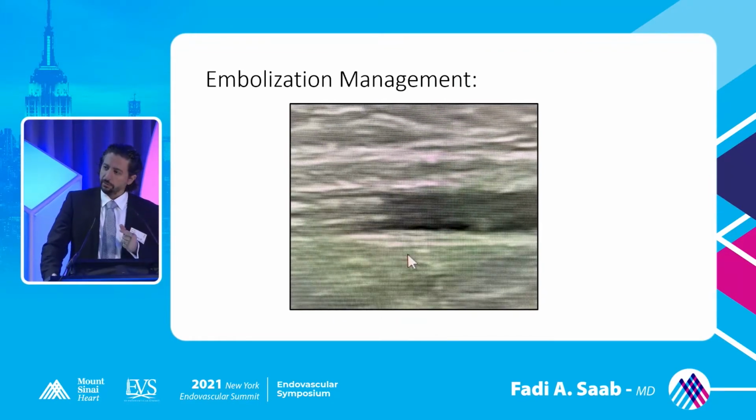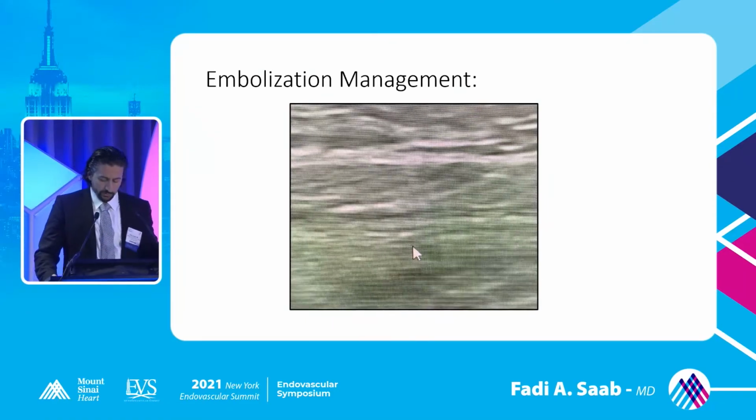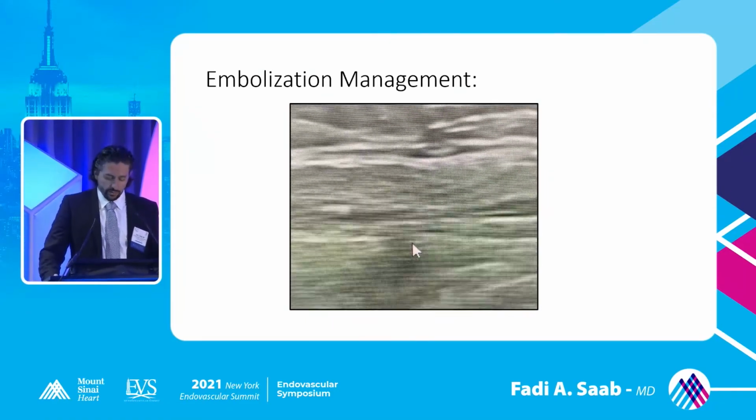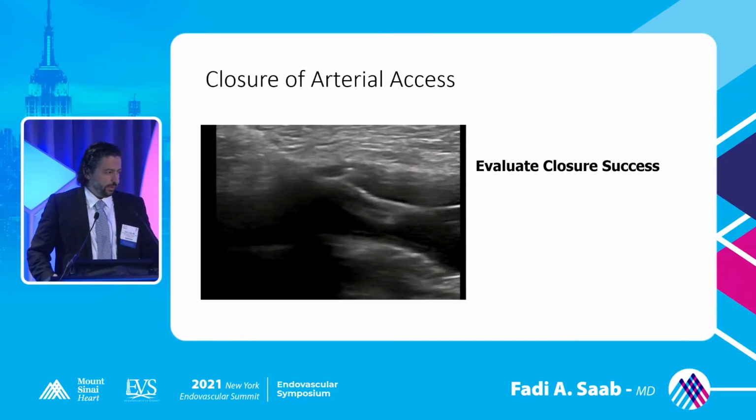We can see it. It's a filling defect on angiography. And when we aspirate, you can see the debris going into the catheter, and I don't have to worry about it. This is a rare occurrence. This is not very common in the practice.